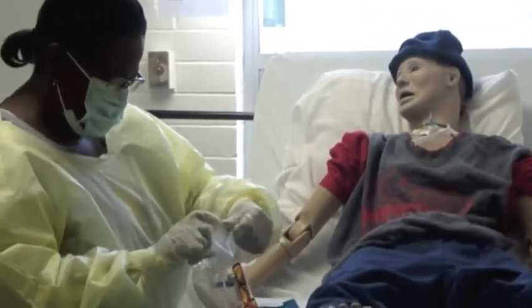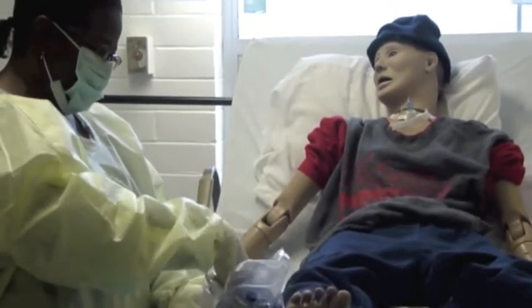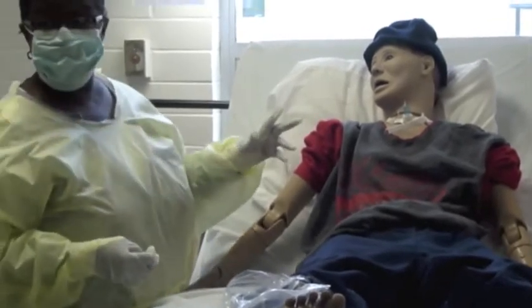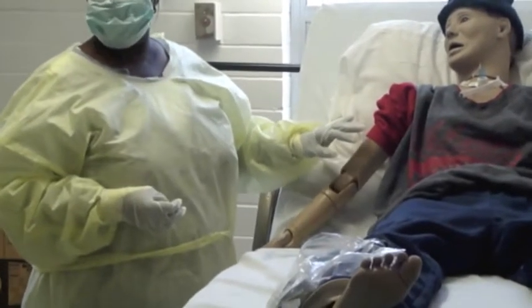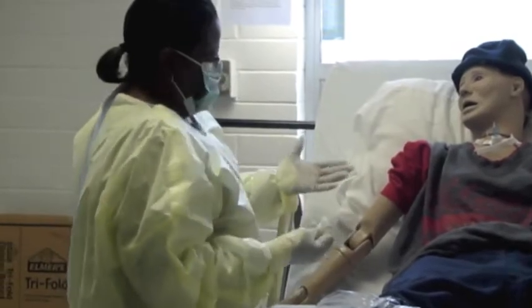You know what I'm going to use. Oops, I don't have everything in here. Sorry, guys. So now I'm going to go ahead and remember, if you wanted to make an indentation, you do that right now. You understand what I mean by that? You feel? You understand the indentation? Yes. Okay, so he's got a good vein.